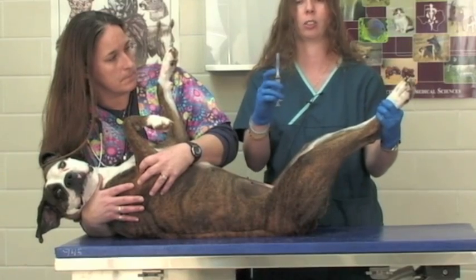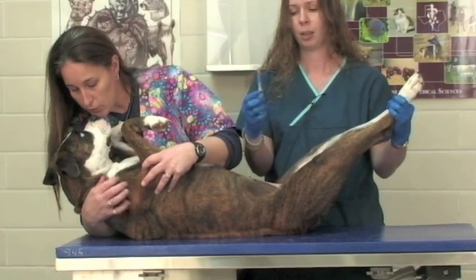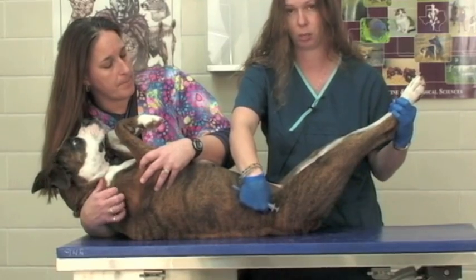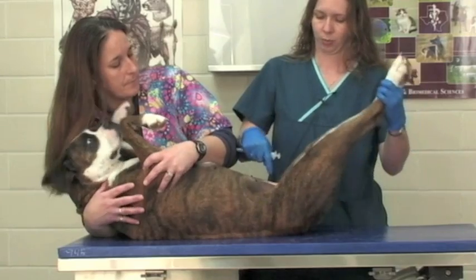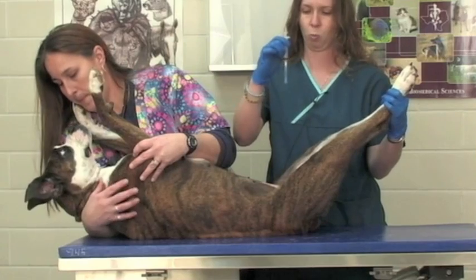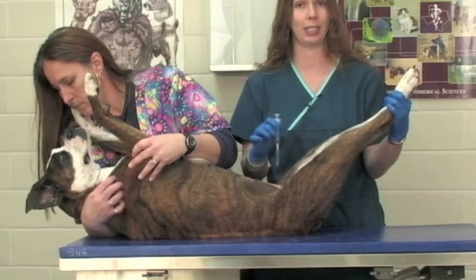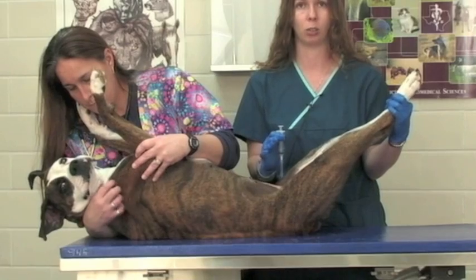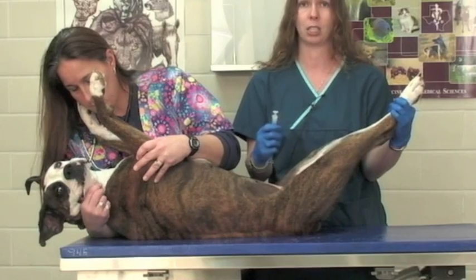When you use a longer needle than a regular needle — this is an inch and a half needle versus our inch-long needles that we use for blood draws — it's because the bladder is probably going to lie pretty dorsally in your patient, so it's going to be further away than a blood vessel would be, and we need a longer needle. So we've established our landmark and we know we want to go straight down right here. We would take our syringe and needle and put the needle all the way into our patient's abdomen right at midline. You want to go straight down. You don't want to redirect at all. Once the needle is in your patient's abdomen, you don't want to muck around with the needle, because you may lacerate a loop of intestine or something else that's important in your patient's abdomen.